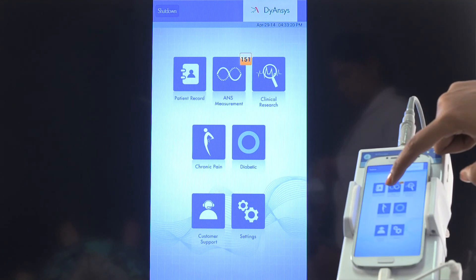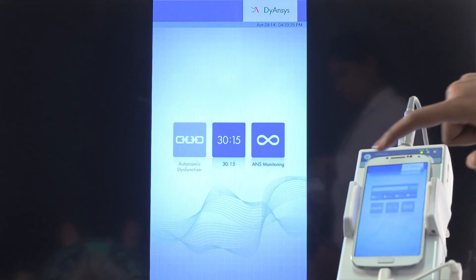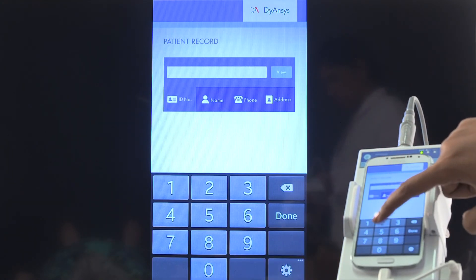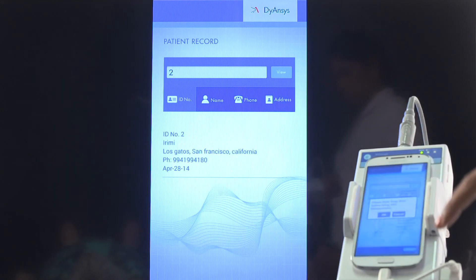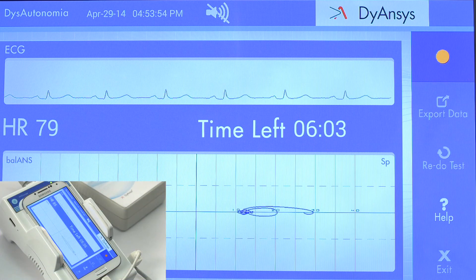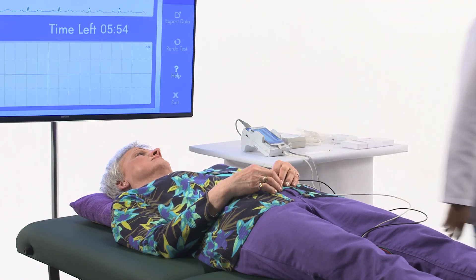Attach electrodes to the ECG cable lead and place the electrodes on the patient's wrists and ankles. Select the ANS measurement icon. Select the autonomic dysfunction icon. Choose existing patient and search through ID, patient name or address and select the patient from the search list. Select the start button in the AD home screen. Observe the heart rate, RR interval and remaining time of the test.